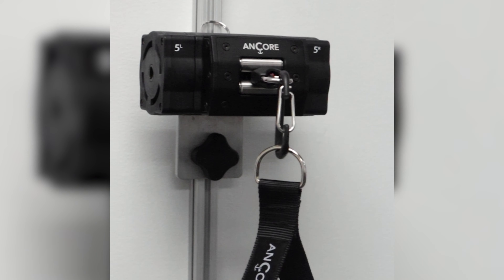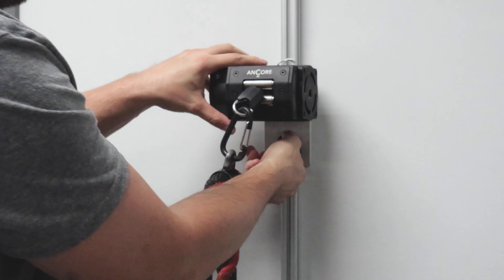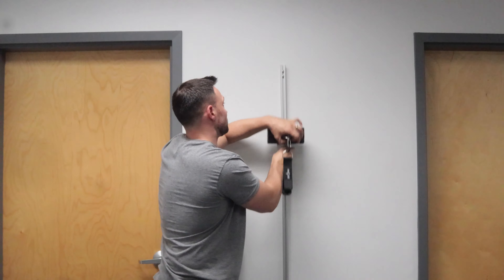One of the main features of our exercise area is the anchor unit we have on the wall. It's an amazing, very convenient tool that we have here in the clinic. We have it on this wall track mount, which is awesome because we can move it up and down easily, depending on what exercise we're going to do.